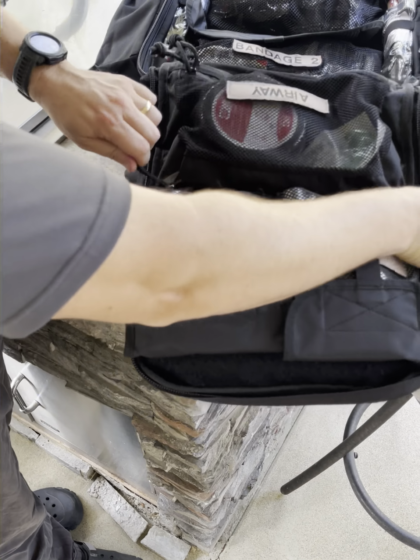And then moving on to this compartment here, you're going to have 4 sets of the vented chest seals and 4 needle decompressions, 14 gauge needle decompression. And then this compartment here is more of like a little boo-boo kit. So gauze pads, and then our full kind of boo-boo kit. So Motrin, Tylenol, burn cream, Benadryl, things like that.